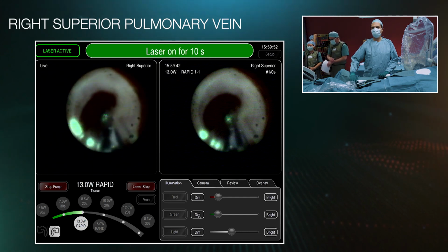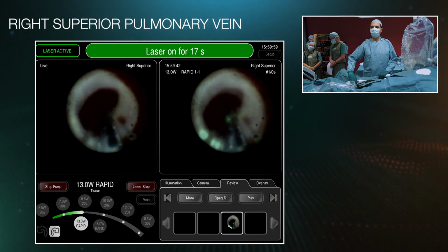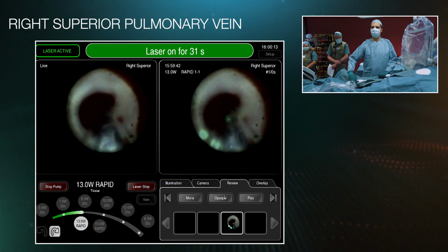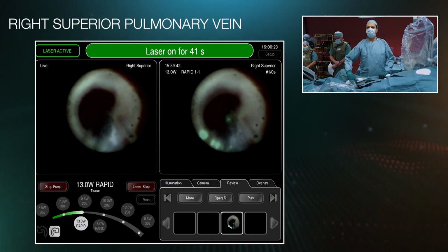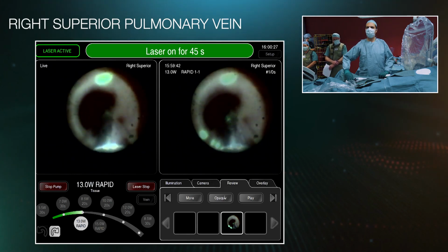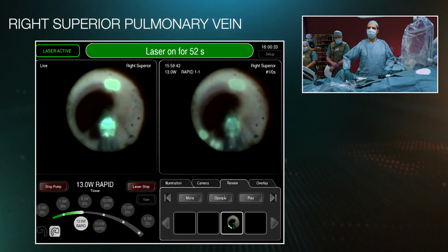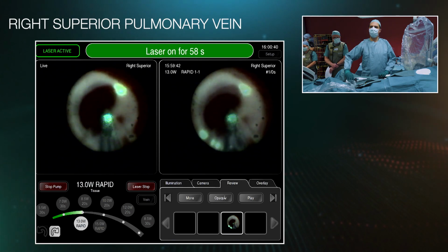And as always, I'm holding my hand on the laser manipulator so I can adjust the depth of the ablation in the ongoing encirclement if needed. So here, for example, I'm going to push in a little bit to stay a little bit closer to the vein. As long as I do this smoothly, the continuous motion of the laser is going to make sure we have overlap. As long as I don't excessively move in or out during my encirclement, I have overlap.